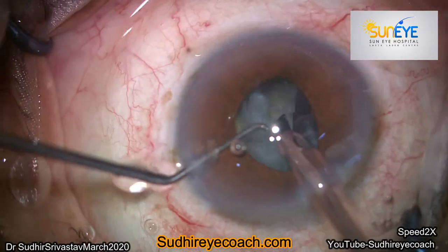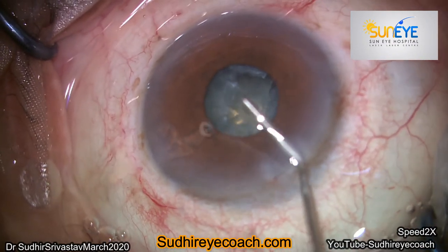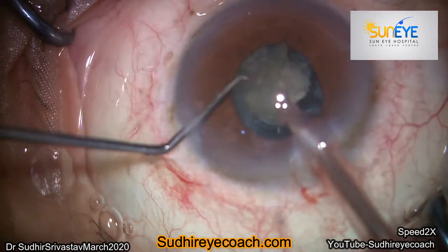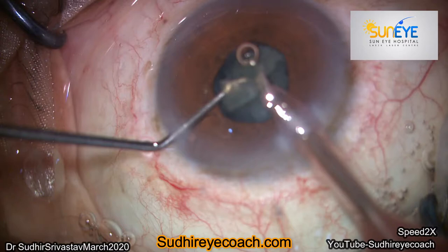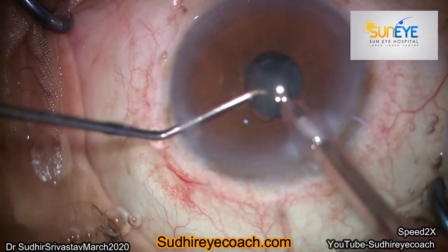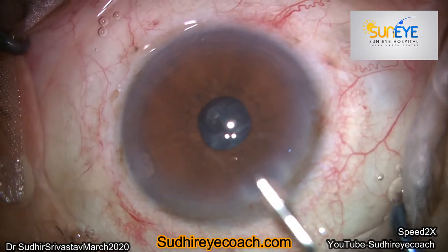For good, safe, and fast phaco surgery, we need to train both hands equally. I was operating on a male patient who was on tamsulosin. A femtosecond laser was being used for the rhexis and for nucleus fragmentation. At the time of the rhexis, the pupil was well dilated and I completed my rhexis without any trouble, but as I started phaco fragmentation, the pupil constricted and almost constricted to two to three millimeters.